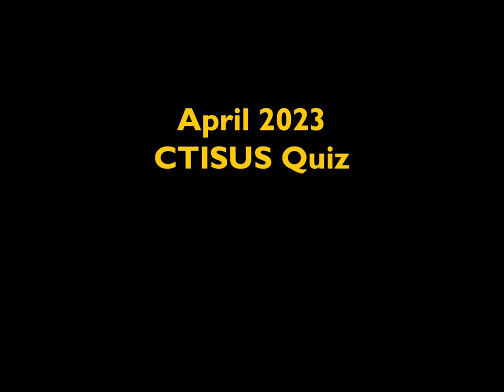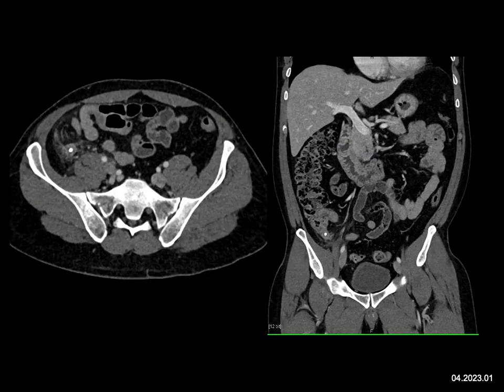The most likely diagnosis in this patient with right lower quadrant pain — this is a classic case. You look at the right lower quadrant and there's a dilated appendix with a calcification present and stranding around the appendix. This is not Crohn's disease, not a small bowel obstruction, and not ileitis.